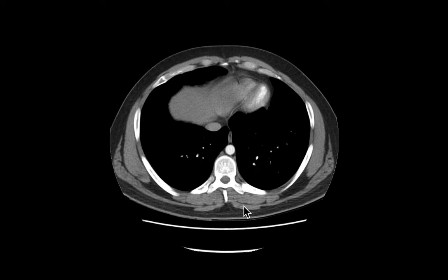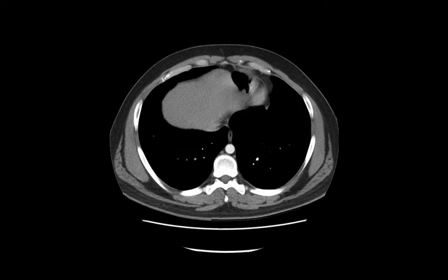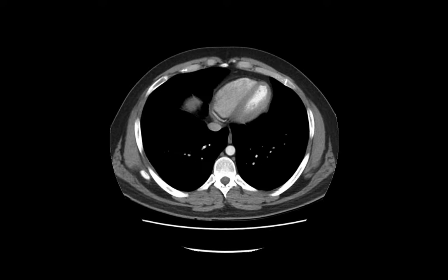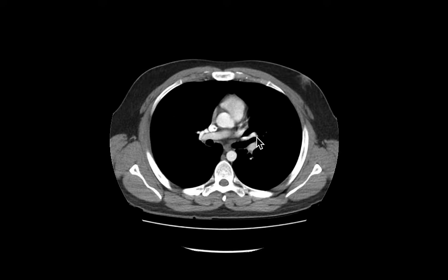Here's our trapezius — beautiful trapezius sticking up right there. Now let's talk about the rib cage, the thoracic wall.